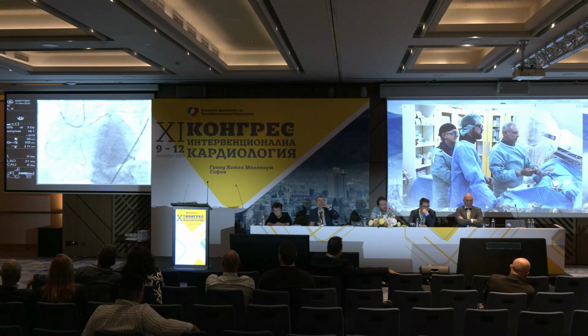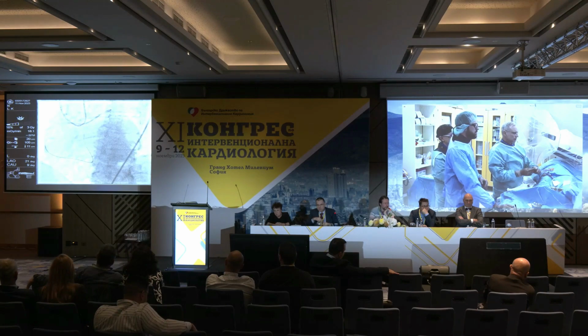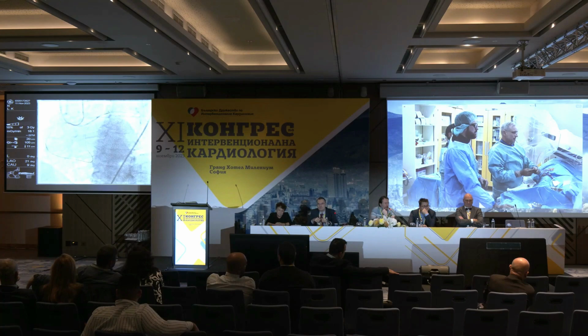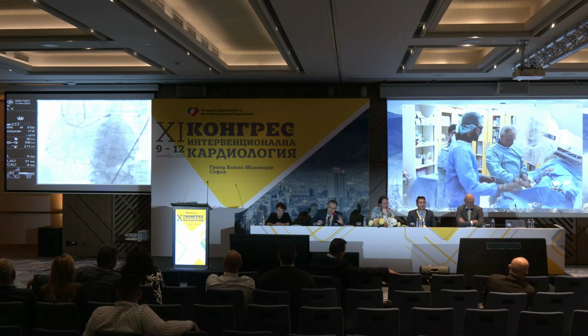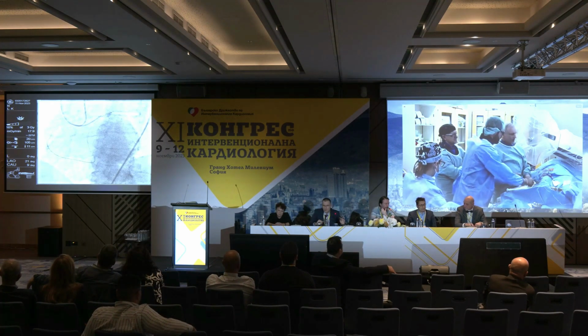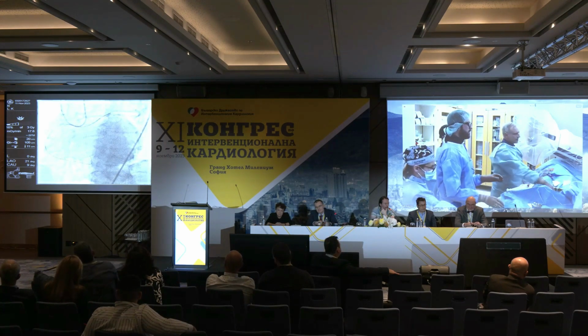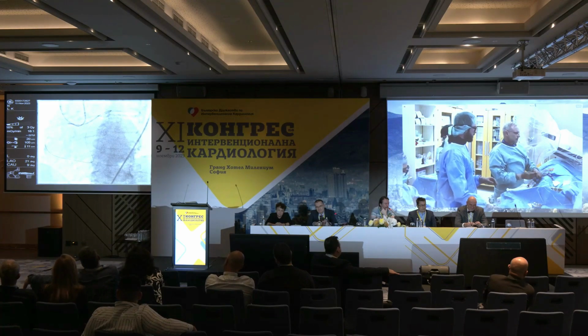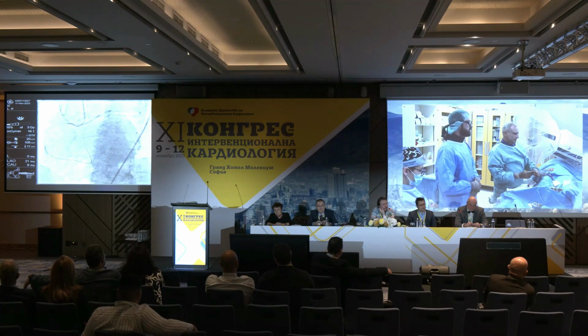Yeah, and the way to do it, first of all, I will try for retrograde wiring just to see if it goes anywhere. And it's obvious, I don't know, I'm not sure, but let's see how this is going up. Yeah, but you are in a good position now. I'm not sure. Which wire is that? George, what is the Gaia 3 from the right. I don't believe that, as you see, all the wires, antegrade, were just following a little bit. Antegrade and retrograde are following the wrong pathway. So that's the reason. So I'll try to puncture in a different direction, finding resistance.